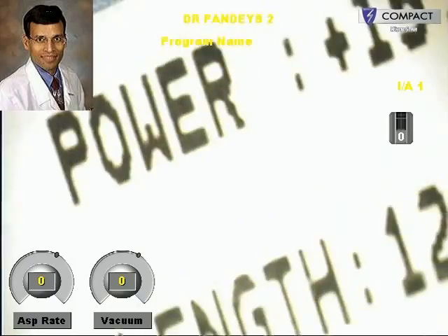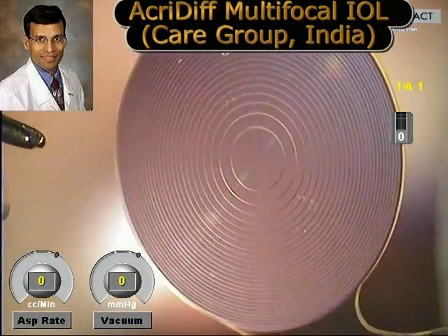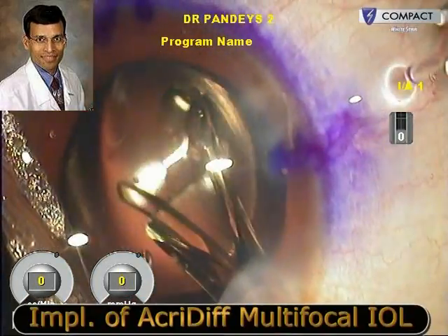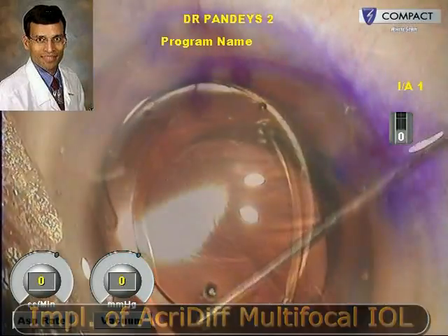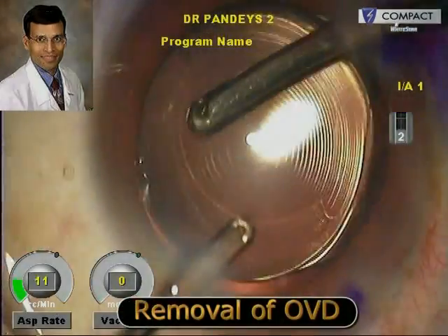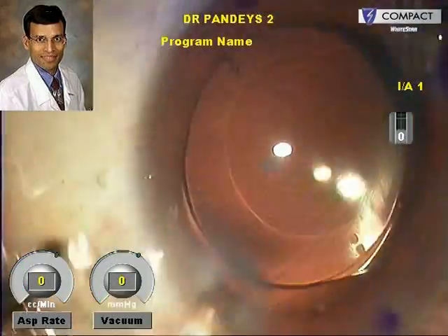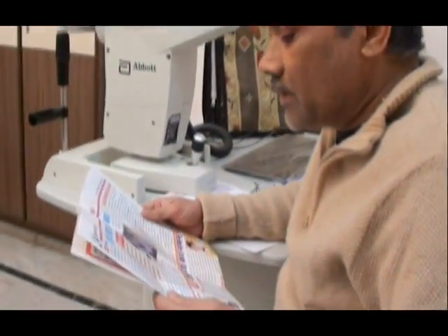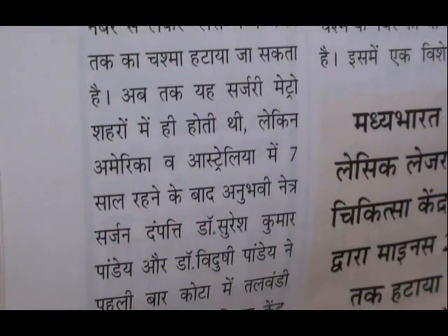Next we implanted an Acri.DIFF multifocal IOL, again available from Care Group India. The standard practice is to implant one IOL into the bag and the other into the ciliary sulcus, but in this case we implanted both IOLs in the capsular bag because for both the toric and the multifocal IOL, proper centration within the capsular bag is crucial to their proper functioning and good refractive results. Finally the viscoelastic is removed from between the IOLs and from the anterior chamber. Postoperatively the patient gained a vision of 6/9 and N6 unaided and was extremely happy with the results.